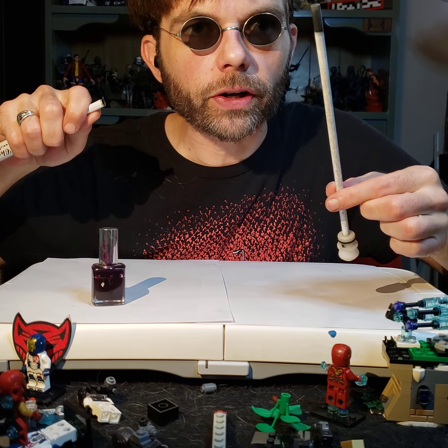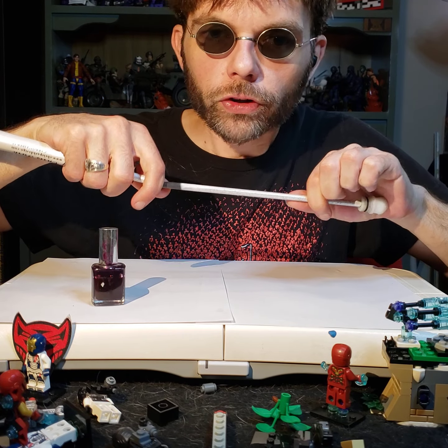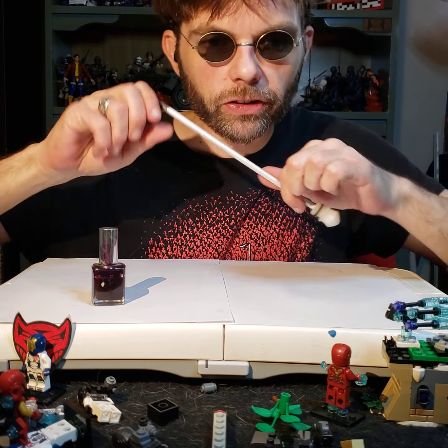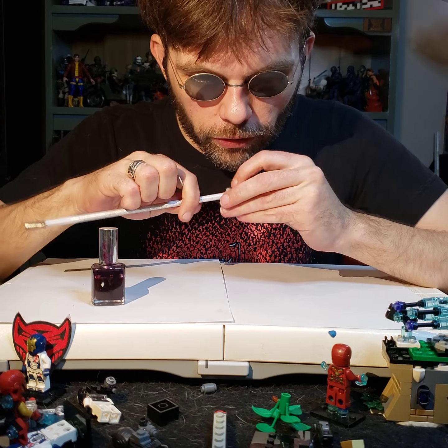This is not good. It's not good if the end of your cane just kind of slides out of the hole. You don't want that to happen at all. So we're going to pull it out of its hole, and we're going to set the rest of the cane off to the side. We've got our bottom of the cane here, and now we're going to come over with our Allen wrench, and we're going to use our fingertips.